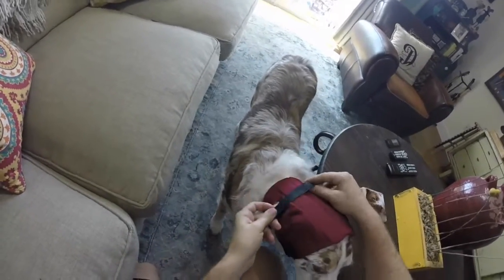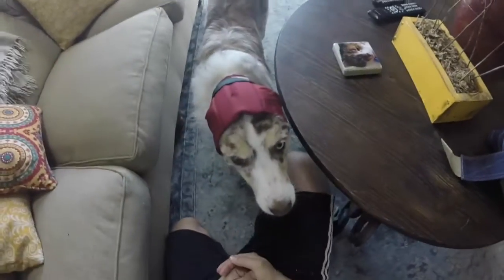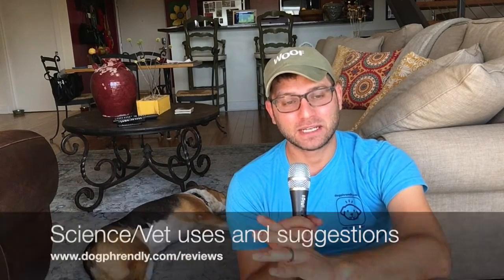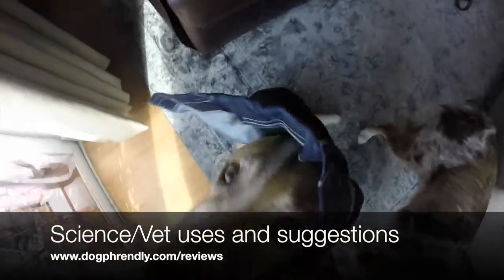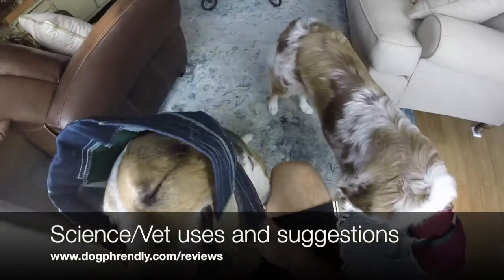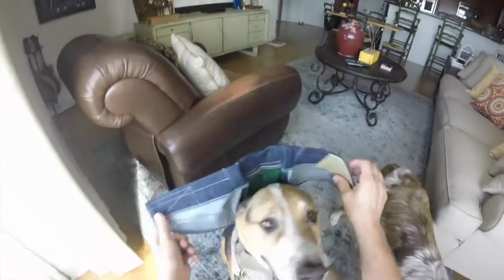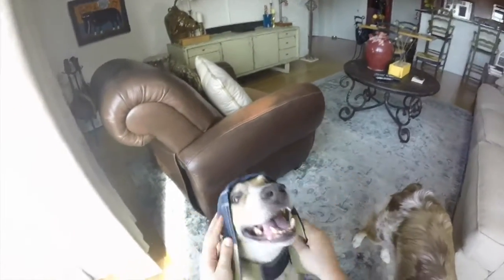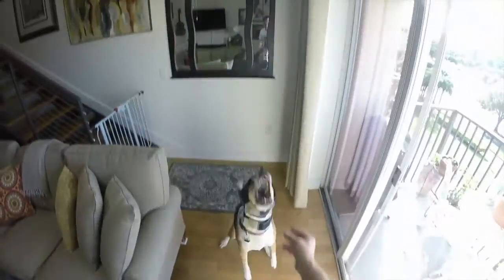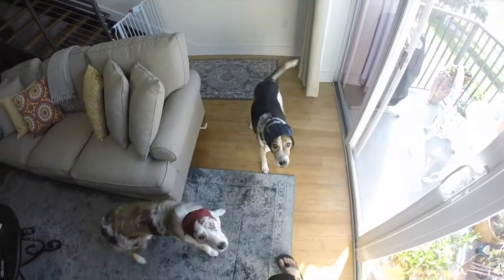You'll see that their ears stay where they are. I'll leave the science and details about aural hematomas and other uses on our blog at dogphrendly.com/reviews. There are lots of reasons you'd use a no-flap ear wrap — for example: ear flap tears, hematomas, post-surgical healing, chronic ear itching, cheatgrass prevention, insect bites or stings, and general ear protection.